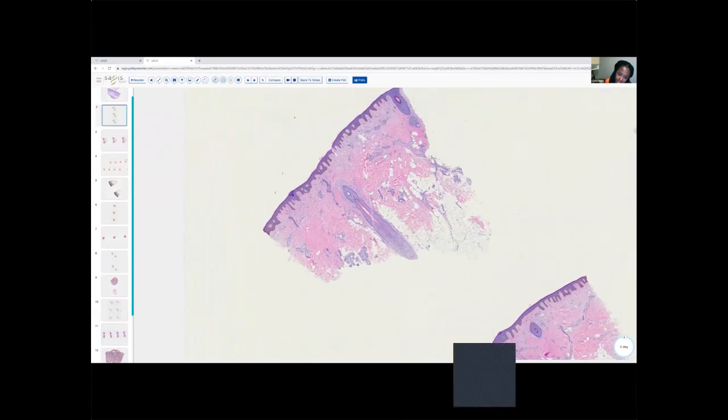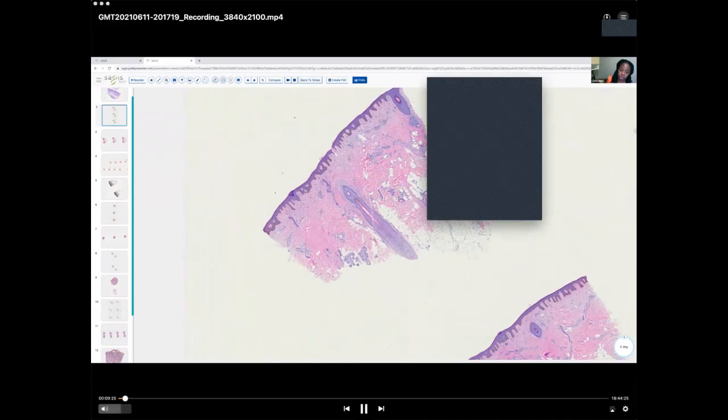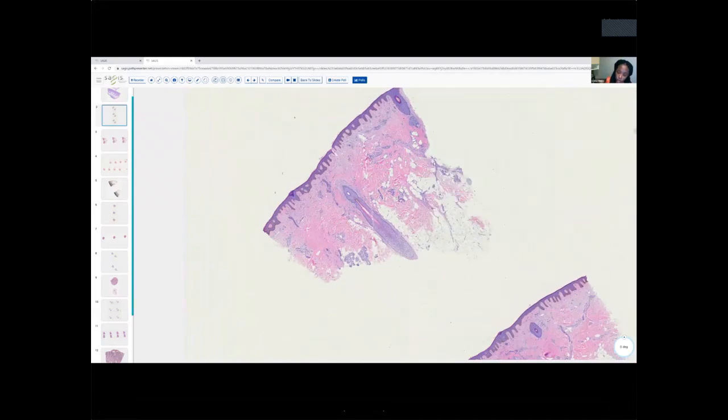The hairs that are present are actually, for the larger part, not situated in the fat. And then most important, and where the hair essentially has traveled upwards out of the normal position, there's a trail that's been left behind in the wake. Okay, so that's called a fibrous stela or follicular stela. So what's causing this? That's the question. Why is this happening?